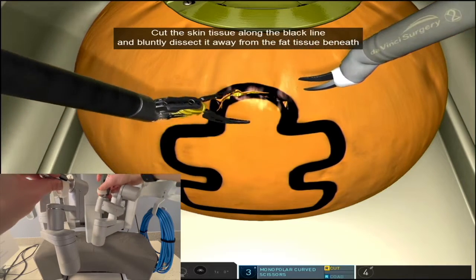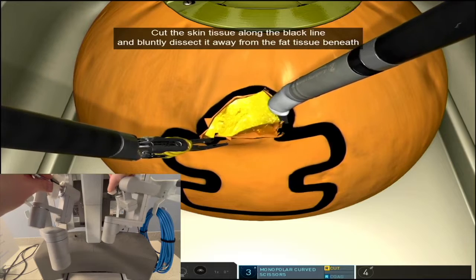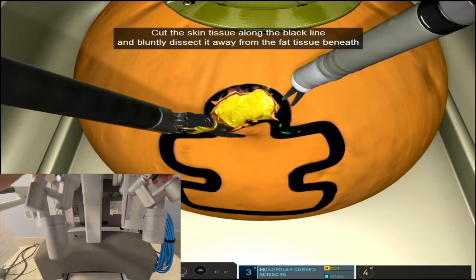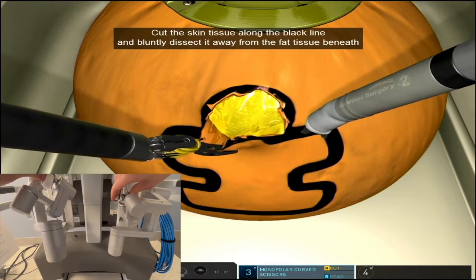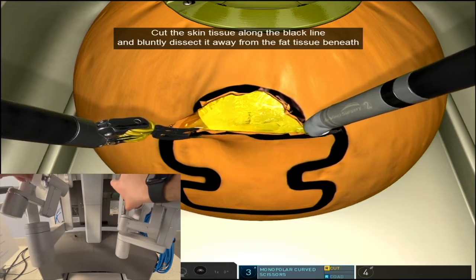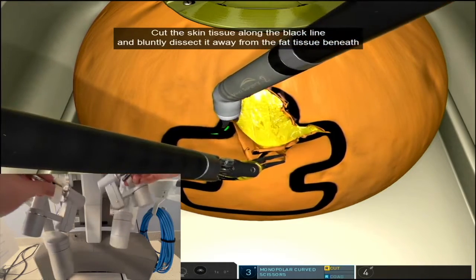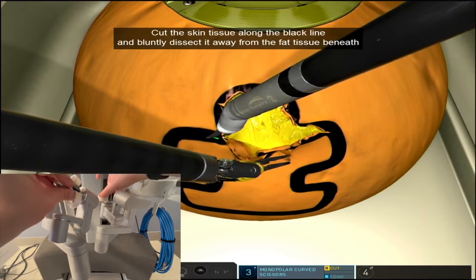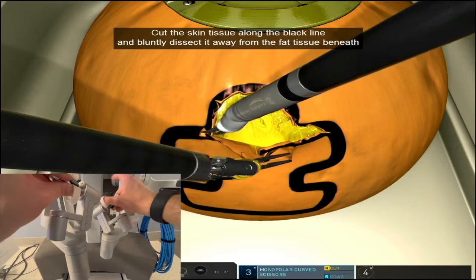As you start lifting your flap off the base of the tissue, you're gonna see that there are some attachments underneath that are presumed to be fat. And you can just use your scissors to bluntly or sharply separate and dissect them, and the piece is gonna slide right off.